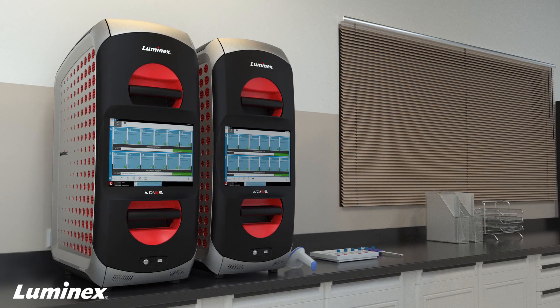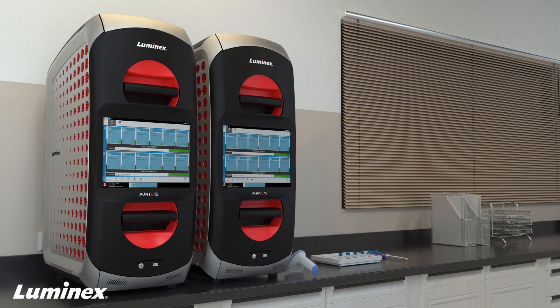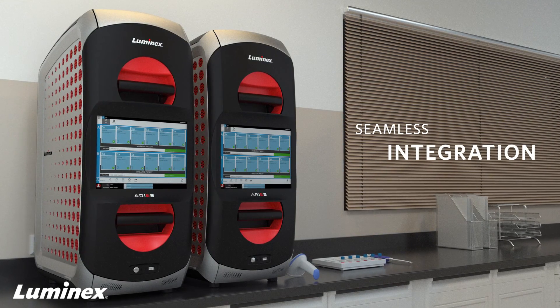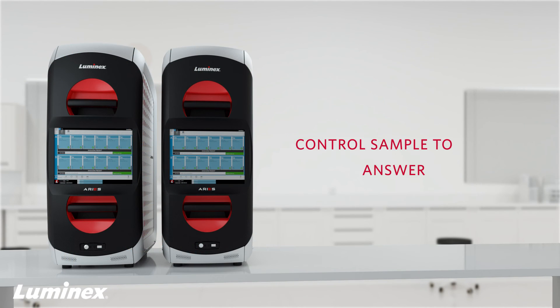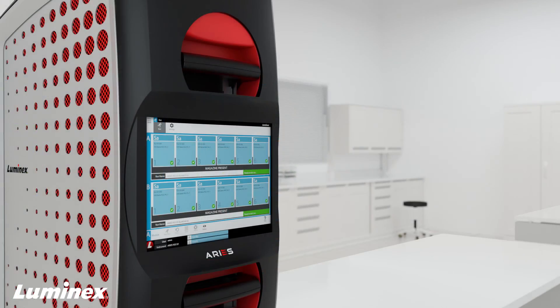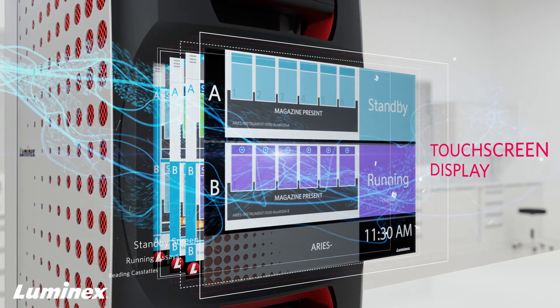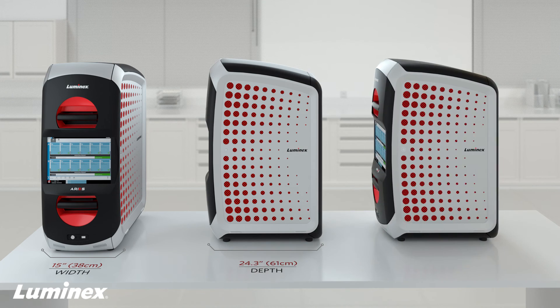Introducing Ares. Crafted to increase laboratory efficiency, ensure result accuracy, and fit seamlessly into today's lean laboratory. Ares allows you to control every aspect of running sample-to-answer in your laboratory. Ares has an onboard computer and touch screen display, resulting in maximized bench space and the narrowest footprint of any sample-to-answer system.